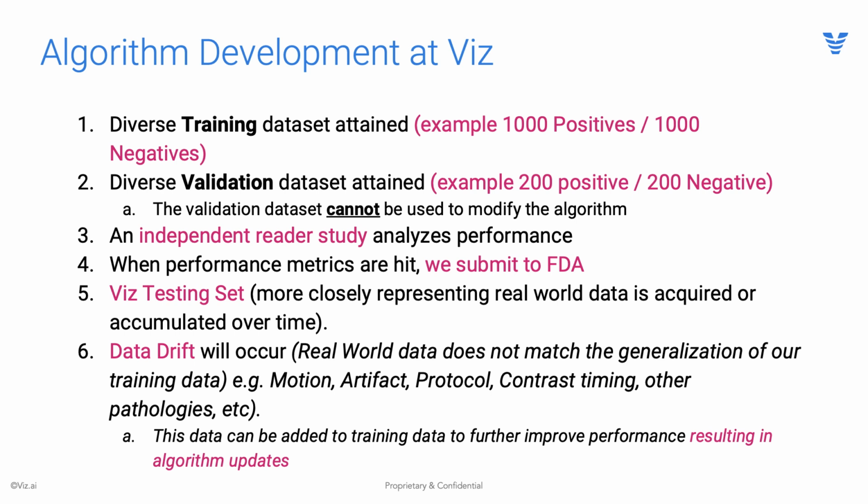And it takes a long time to do this, and the algorithm engineers do this steadfastly against each individual CT that they receive. We obviously are looking for a robust and diverse training data set, but it would be impossible and implausible to have it be representative of everything that the algorithm will ever see.